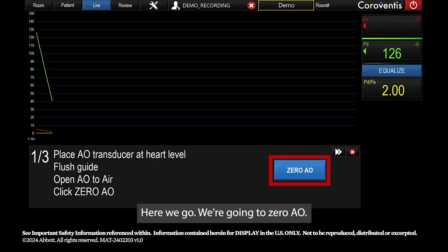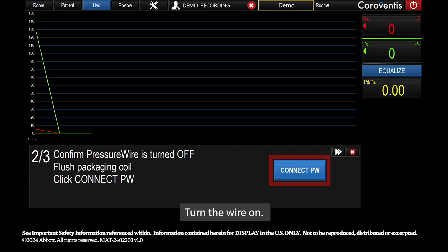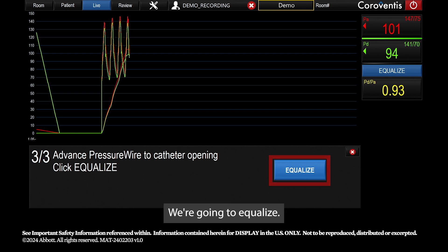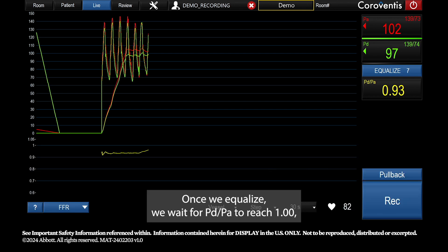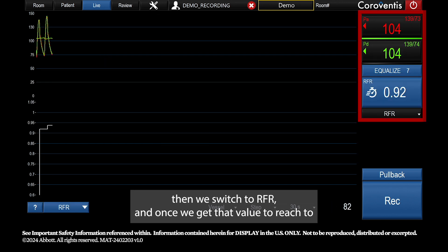Here we go — we're going to zero AO. Once we do that, we will connect the pressure wire and turn the wire on. With the wire in the left main, we're going to equalize. Once we equalize, we wait for PD over PA to reach one, then we switch to RFR.